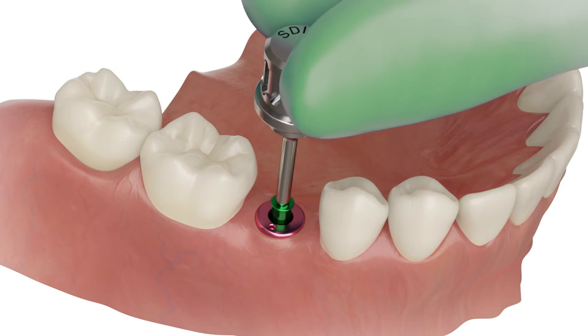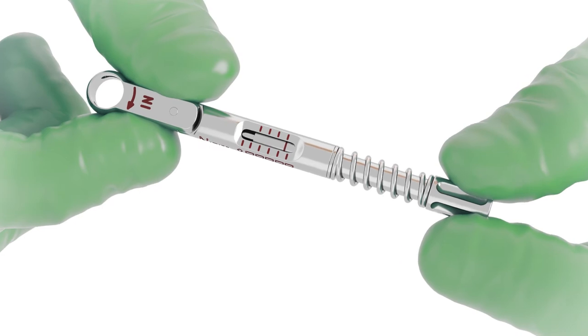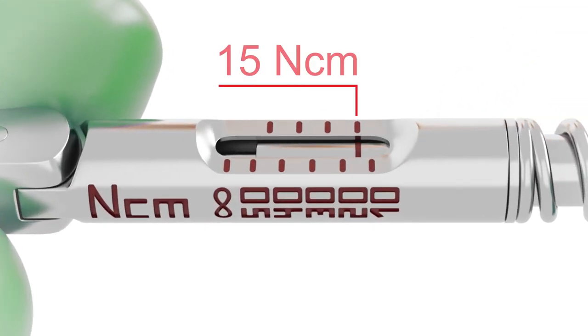Screw the healing abutment back with 15 Newton centimeters torque.